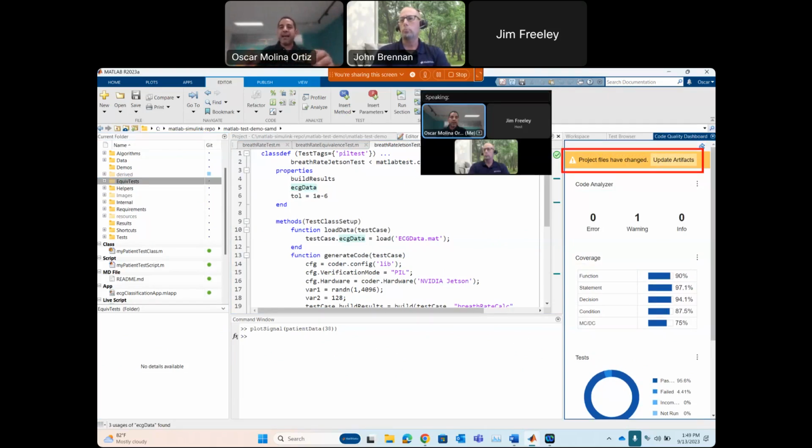So MATLAB is actually being kind of your co-pilot when it comes to testing, because it's telling you, hey, something's happened. Have to change this function? Want to take a look? Do you mind rerunning this unit test? So you have the peace of mind that MATLAB will also be somehow monitoring changes in your code. So that's the one thing.